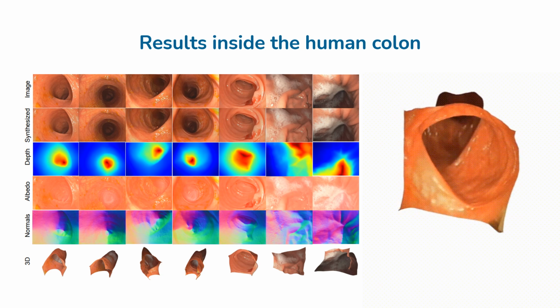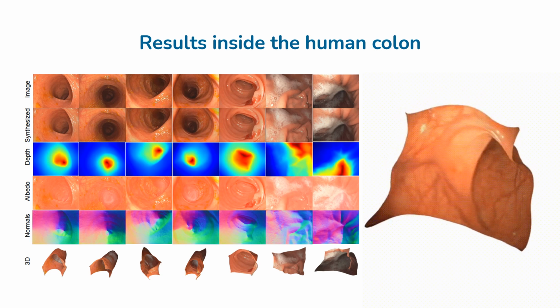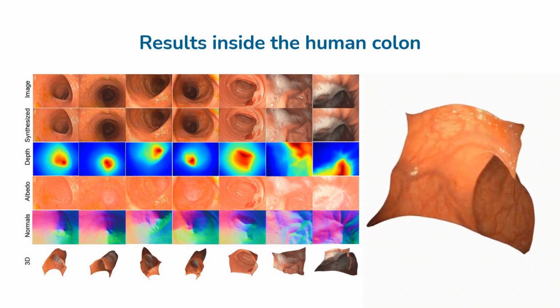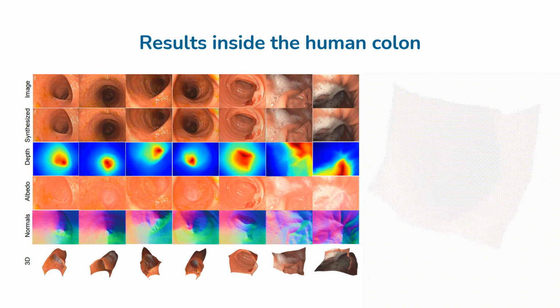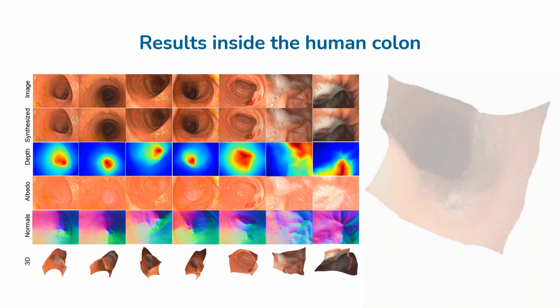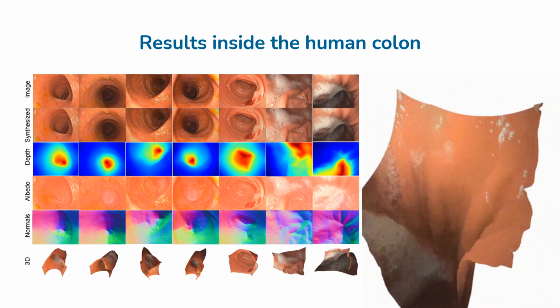Illumination decline is a very strong self-supervision signal. It allows us to obtain consistent depth estimation without requiring any ground truth supervision. This opens the way to depth estimation in endoscopy, where ground truth is not available.